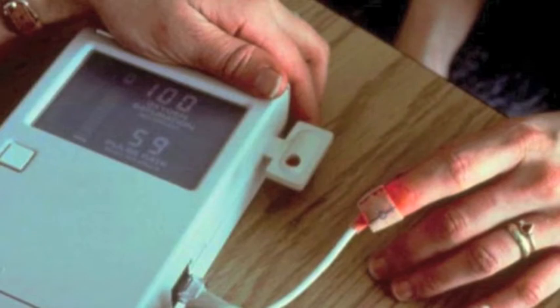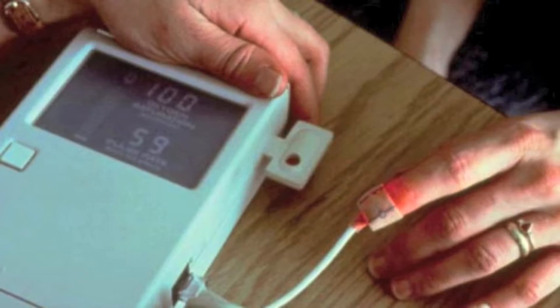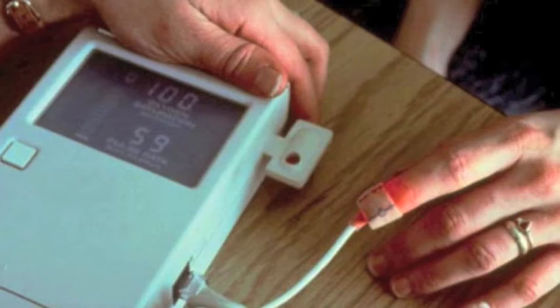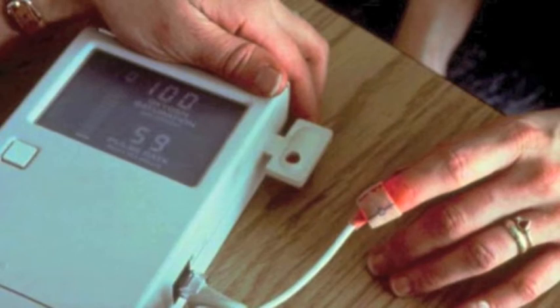If you want to record the pulse rate more accurately, or over a longer period of time, you use a device called a pulse oximeter. This can measure two variables, your pulse rate and how much oxygen is in the blood. Pulse oximetry is a simple, non-invasive, and continuous method of monitoring your heart rate.